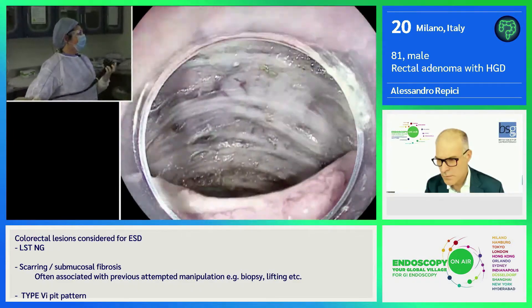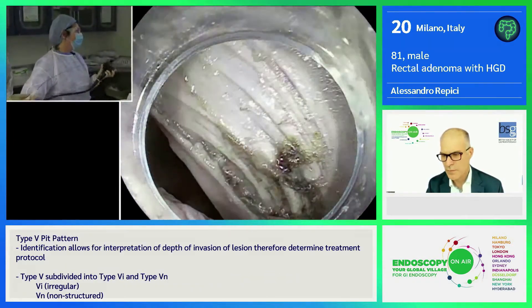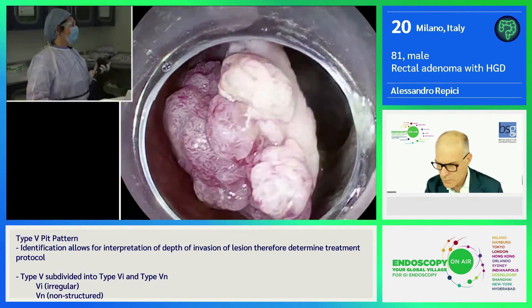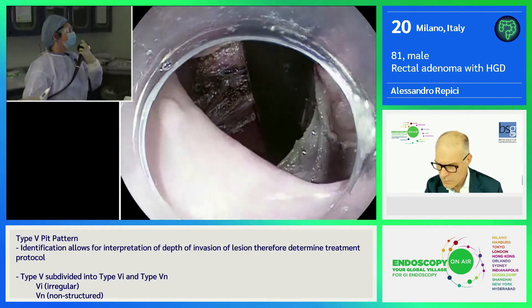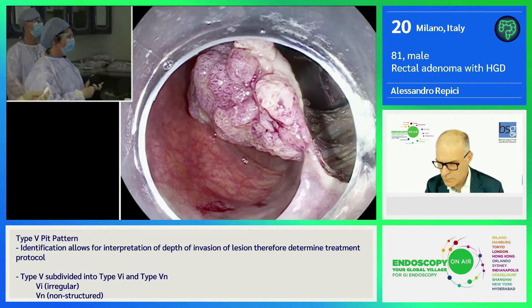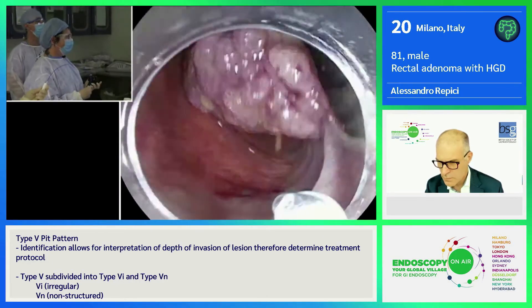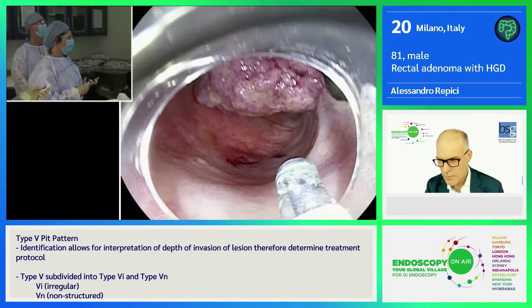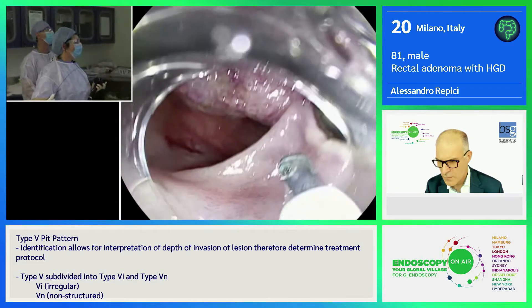I'll show you exactly what I did. I did the tunneling, so I can enter into the tunnel and retroflex. This maneuver gives me the traction that usually we don't have during ESD. The other knife is inside. So you're saying you're using the traction modality just with the scope and with gravity, nothing else? No.